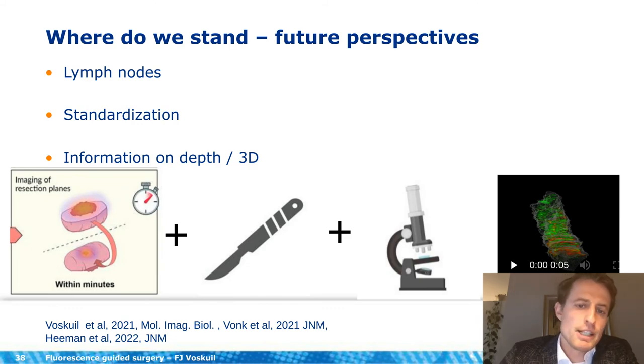And we believe that only looking at the fluorescent lesion alone does not give us enough information, because the fluorescence can come from a couple of millimeters below the surface, which is actually enough margin in some tumor types. So a strategy for that is to obtain directly a guided fresh frozen sectioning guided by the fluorescence, which then can be analyzed using 3D fluorescent imaging. And in the not too far distant future, I believe that upgrades are mandatory, and they are coming on devices which generate 3D information on the fluorescent compound.